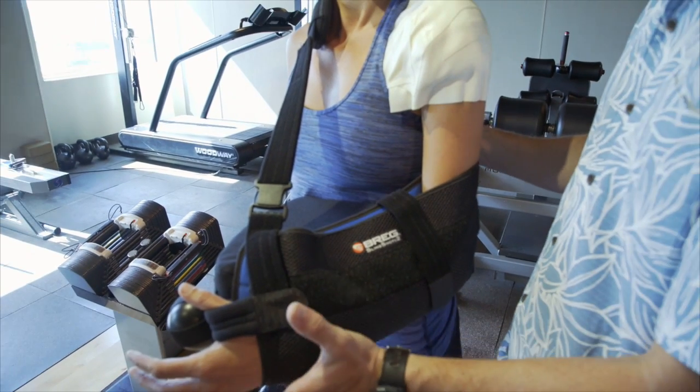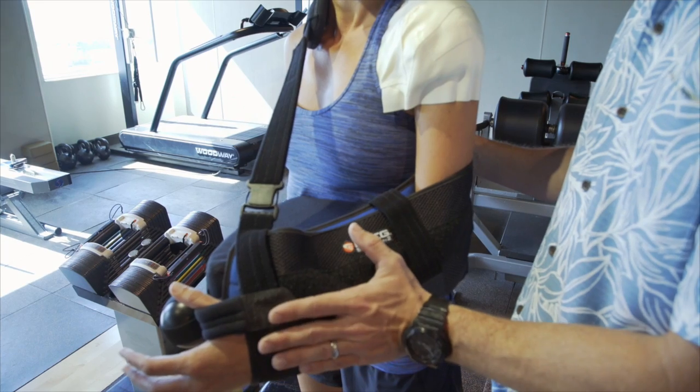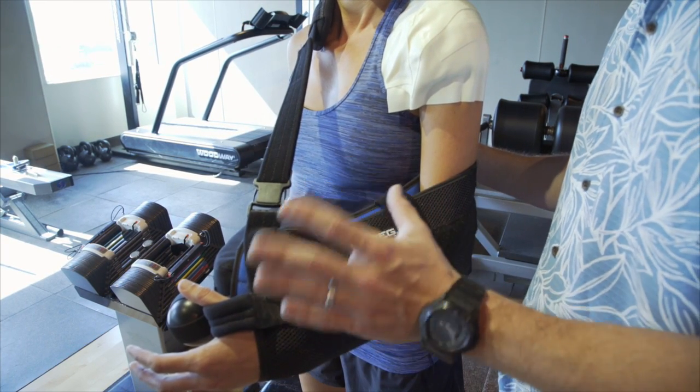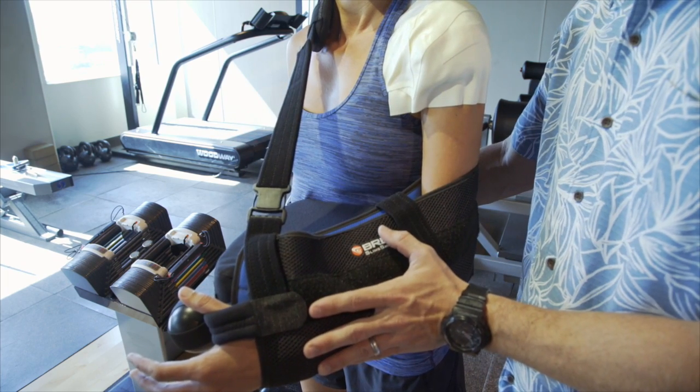The first thing you're going to do is take the brace off. This can be a little confusing and daunting at first, but it's actually quite simple. Everything has been fit for you in surgery, so you shouldn't have to do too many adjustments of this or the waist strap around your midsection.